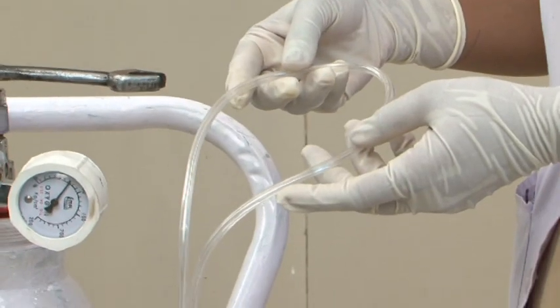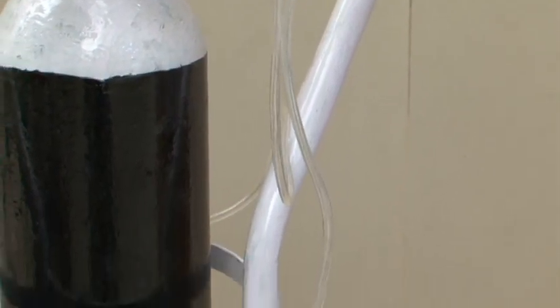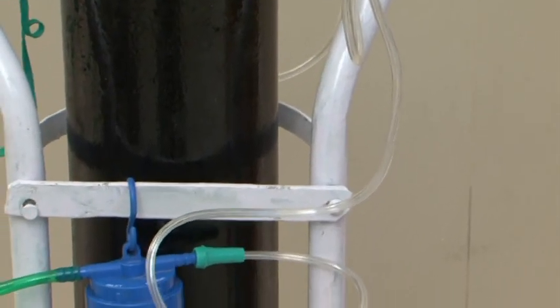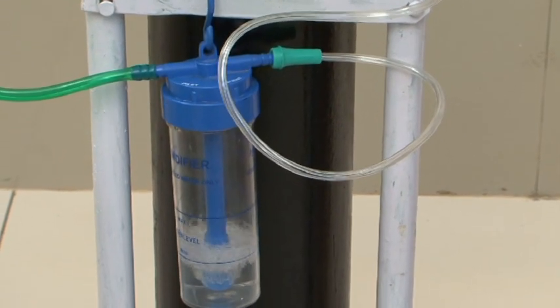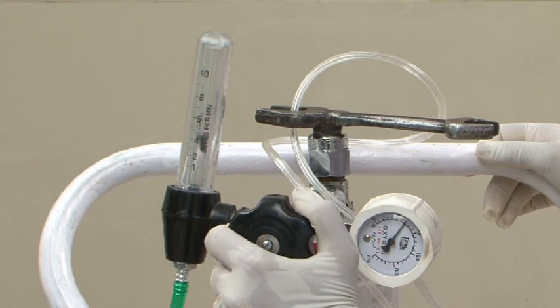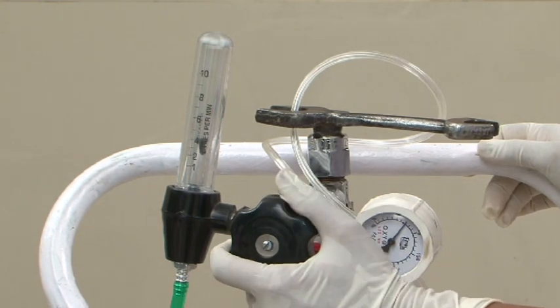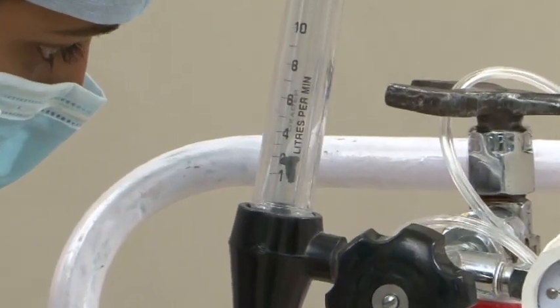Use proper tubing for oxygen supply, since hard plastic tubing will not easily bend or kink and interrupt oxygen supply. Adjust the flow of the oxygen in liters per minute with the knob on the flow meter. Read the flow from the middle of the ball in the flow meter.